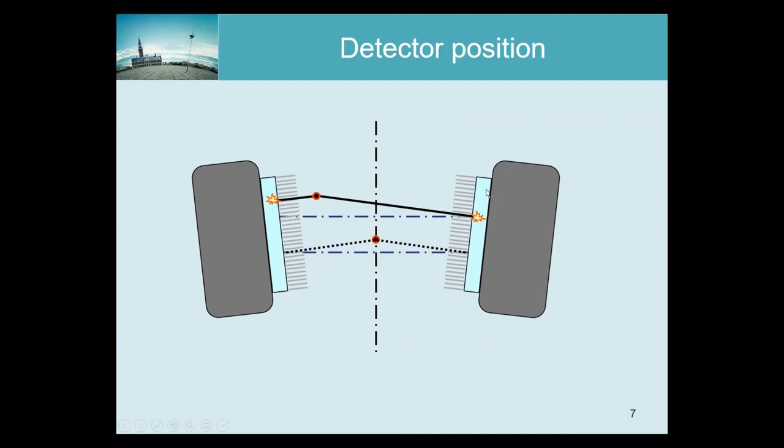If you see that, you almost certainly have to call the company. They will have to make sure that when you tell the gamma camera to go to SPECT position, it is at the right angle.